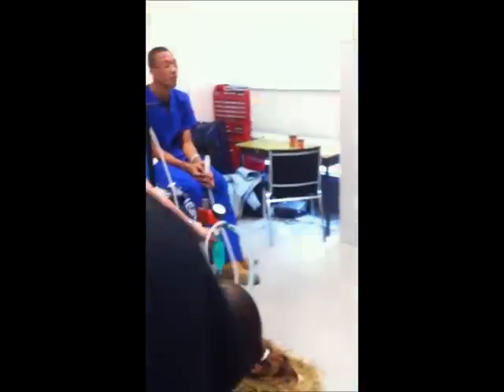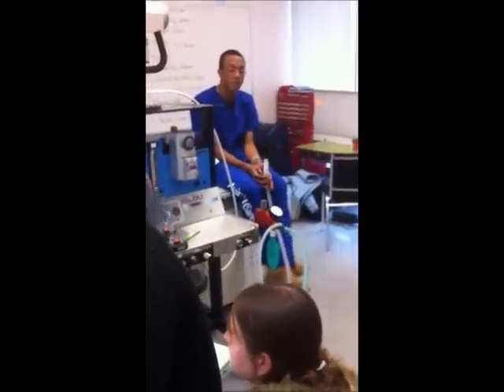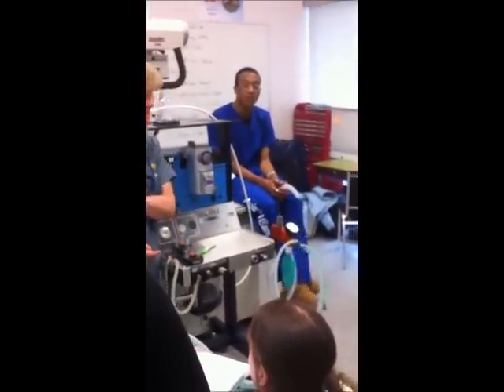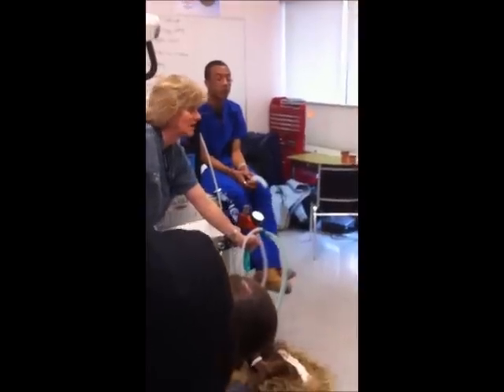I've got his lungs captive because I've got him intubated, which is, in my estimation, better than if I have to do CPR on an animal just breathing into the nose. Because what I breathe in there is not 100% oxygen, but what's coming through this machine is. So I squeeze the bag. Because this is closed, that can only go that way into his lungs.